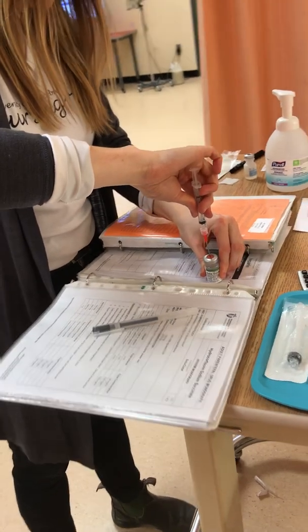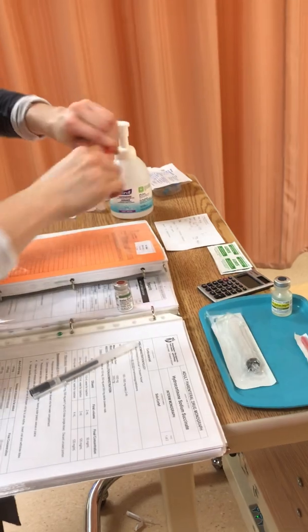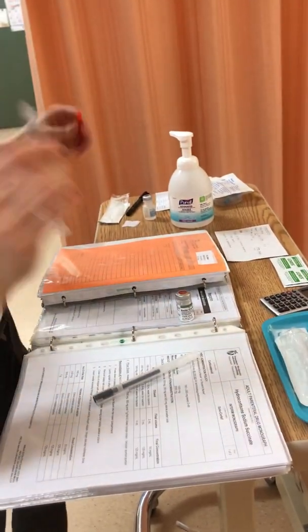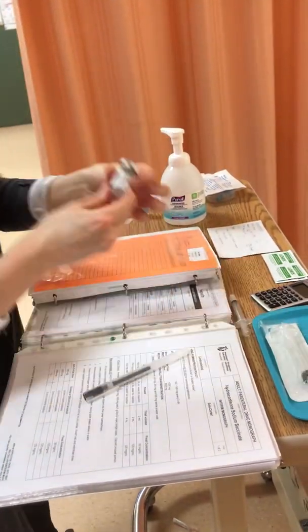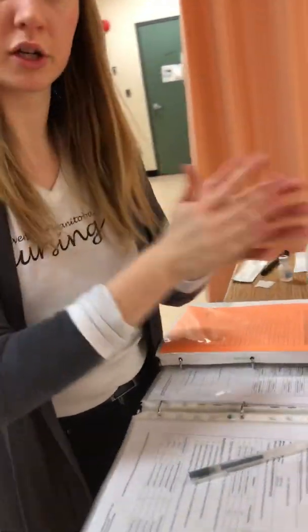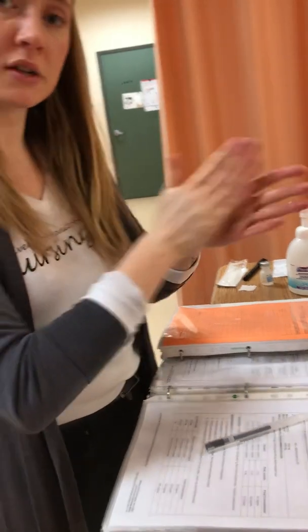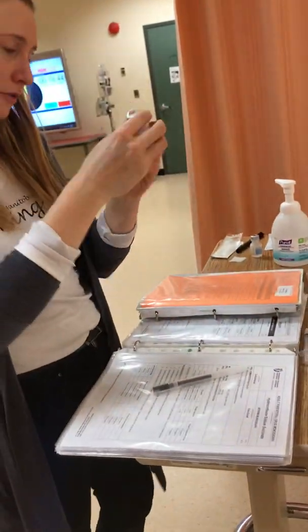Okay. I would dispose of this in a sharps container. So at this point, I will roll this around, ensuring that all the medication is dissolved. While I'm rolling, I know that I'll be watching my patient for signs of hypertension, mood swings, and monitoring for hyperglycemia, so I will take a blood glucose level afterwards.